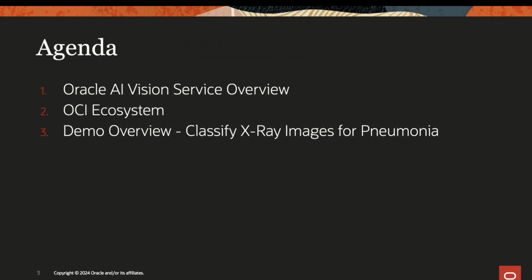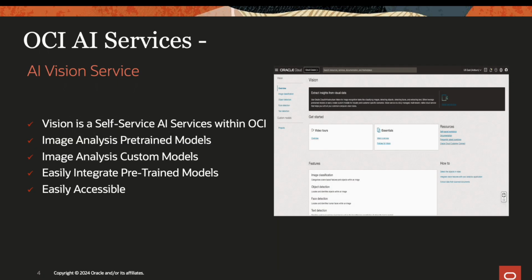Today's agenda will show you the Oracle AI Vision Service overview, and then we will discuss the whole Oracle Cloud Infrastructure ecosystem and how that works with Oracle AI Vision Service. Then we'll discuss a demo called Classify X-ray Images for Pneumonia.